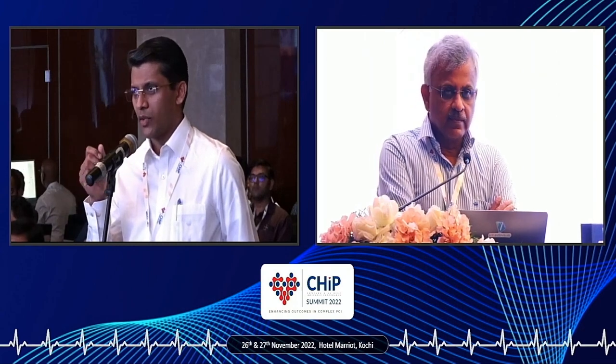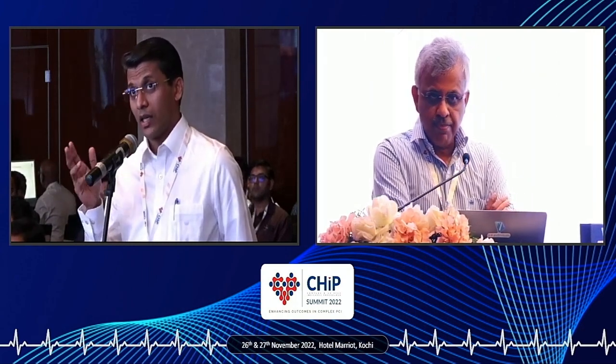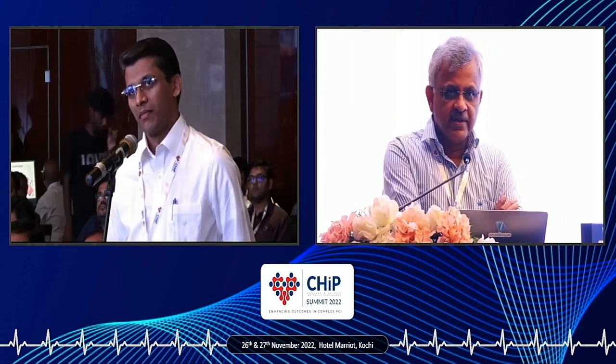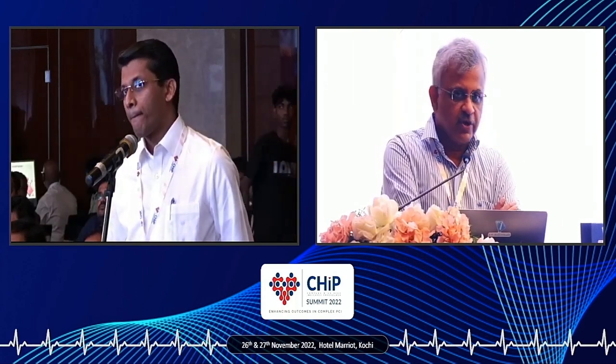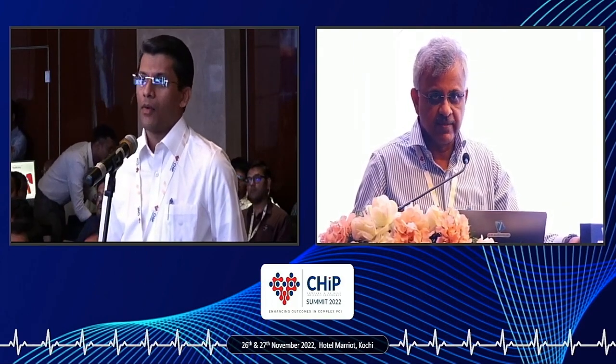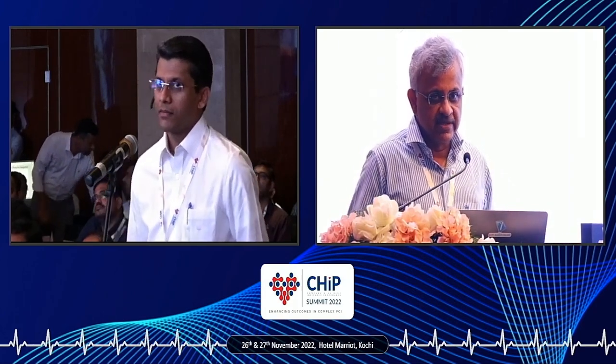Hi, hello sir. It was a nice talk. I have a doubt regarding the MERES 100, the bioresorbable vascular scaffolds. I understand that once we deploy a certain size, we can only upsize it by maybe 0.25. So suppose you are deploying the stent across a large side branch, how do you size your bioresorbable vascular scaffold? I don't deploy it across the side branch. I'm very clear. If there is a very significant side branch, I avoid scaffold. I will only go with a normal stent. So far, no studies support me to use it in a bifurcation with the side branch. It requires 1:1 pre-dilatation, the size cannot be beyond 0.5, and imaging is mandatory.